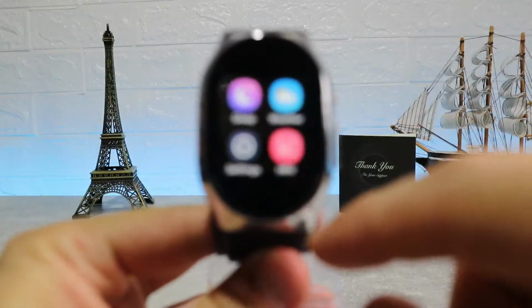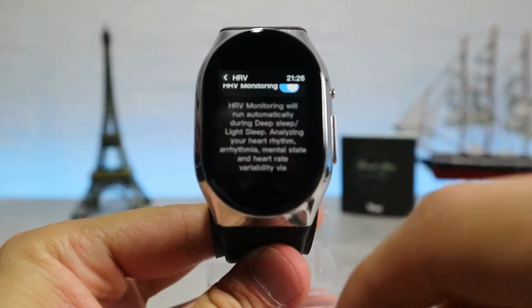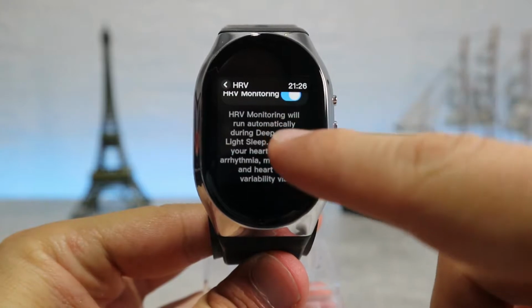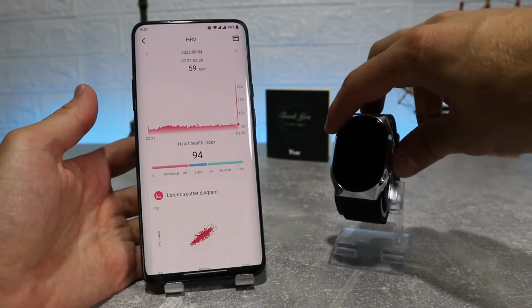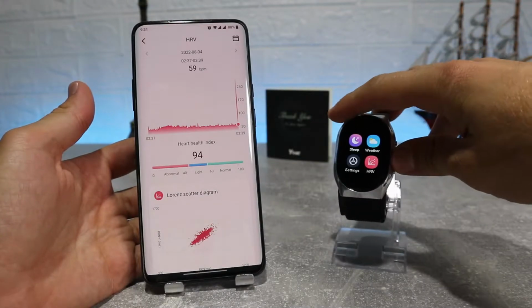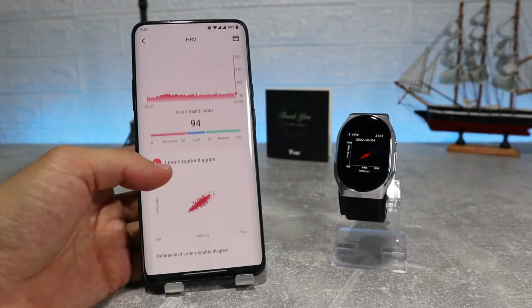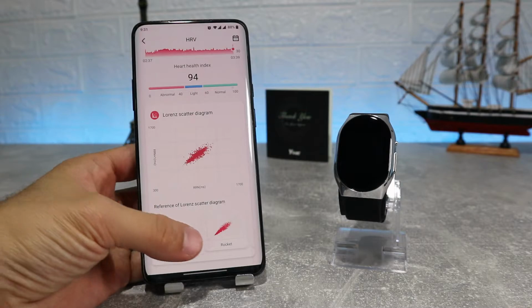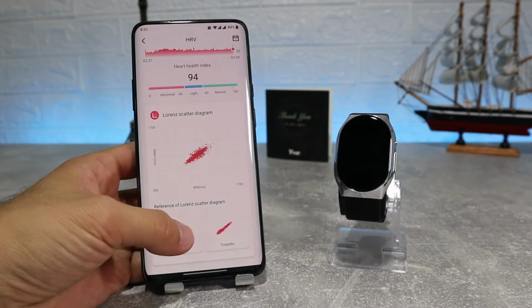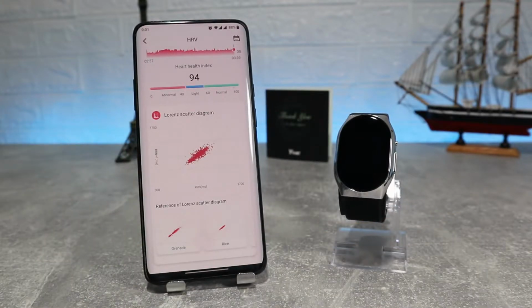By making the most of its sensors, the watch will indicate the state of your HRV. That does not tell us more, but more details will be provided in the app. HRV measurements can help identify anomalies, and a reduced HRV is associated with an increased risk of death, arrhythmias, and heart attack. Heart rate variability has been gaining much attention in recent years, and a low heart rate variability is often associated with health or psychological disorders.